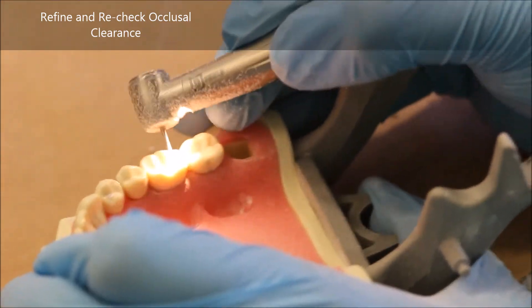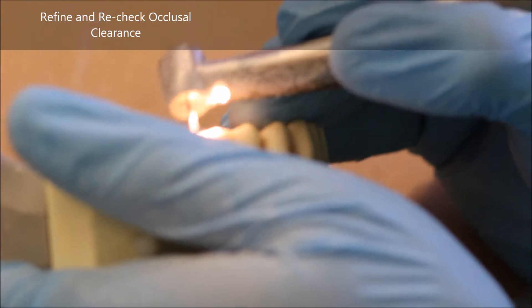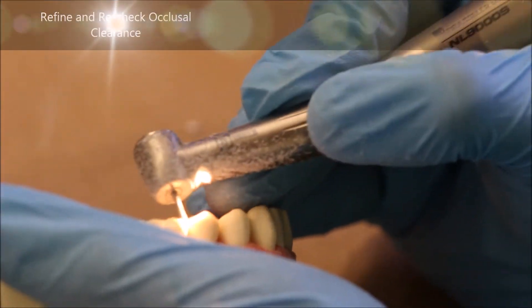If your RGS4 fits, that generally signifies that you have more than 1.5 millimeters, which is on the excessive side.